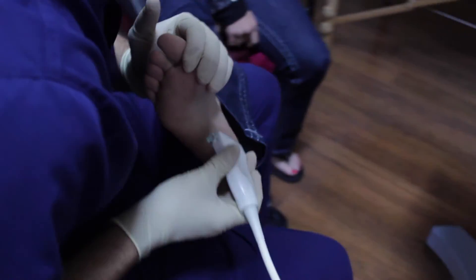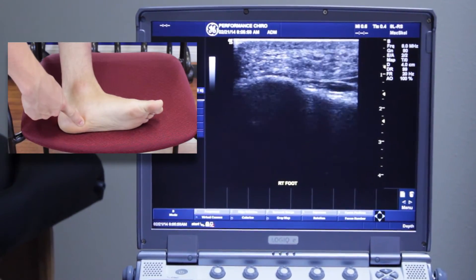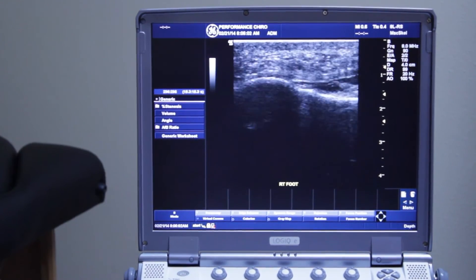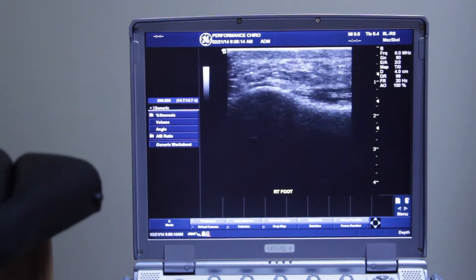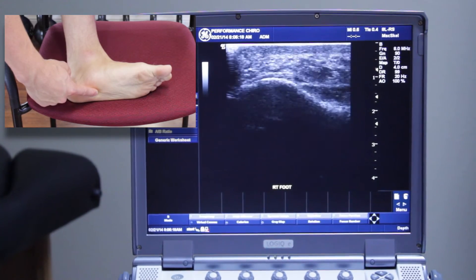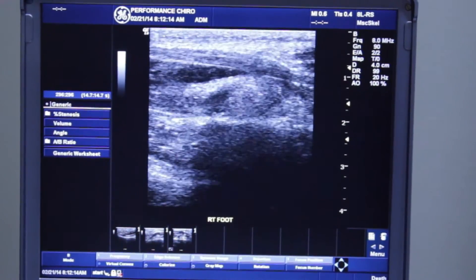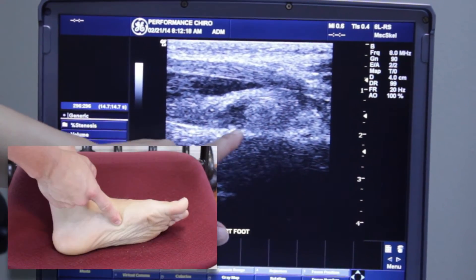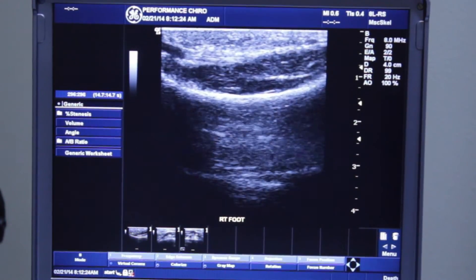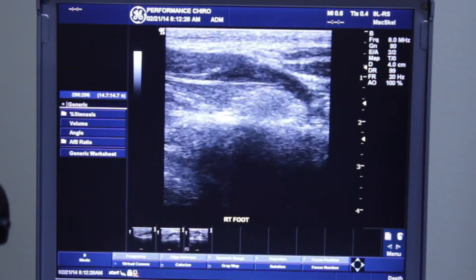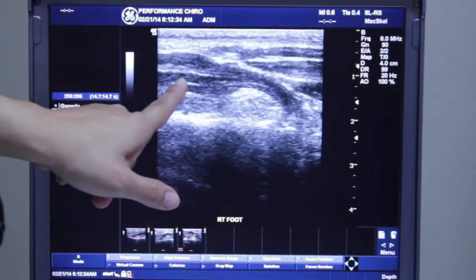Let me start on the heel and take a look. That little dome right there is the medial tubercle of the calcaneus, and the plantar fascia is coming in right there. It looks really nice here — this is the most typical spot and usually where we see a lot of plantar fasciitis. But in this area, I start to see a hypertrophic, kind of balled-up knot compared to right above the bone, where it's very homogeneous and nicely striated. So you get down to right here and you just get this kind of irregular appearance.